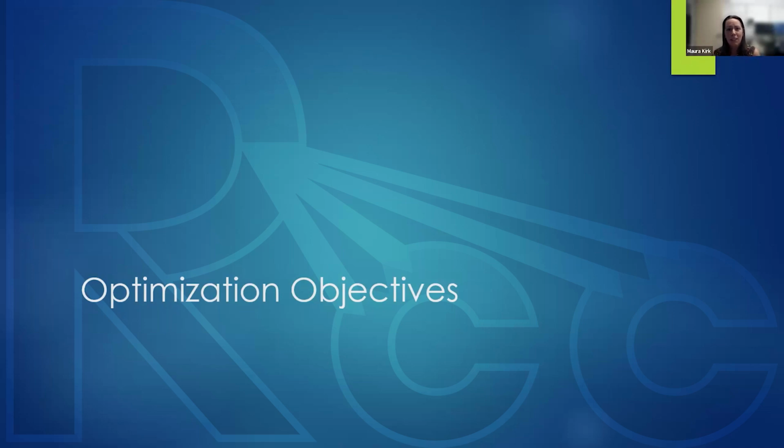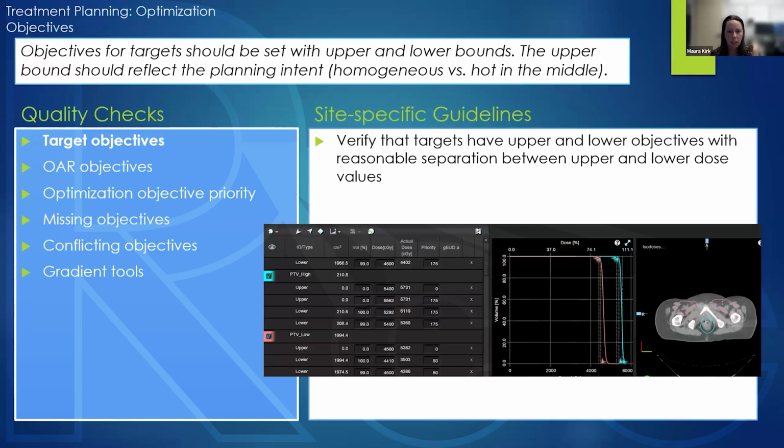There are techniques, actually, which I'll discuss in 2 weeks for craniospinal optimization, where using multiple isocenters in the longitudinal direction, you can make kind of a robust optimization of the dose along the match line so that you don't need to feather. That's kind of a more in-depth planning description, but I will go into that in 2 weeks if you're available then. All right, so we'll go into optimization objectives.